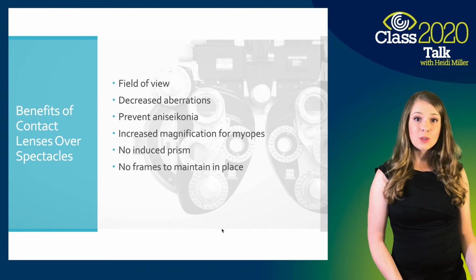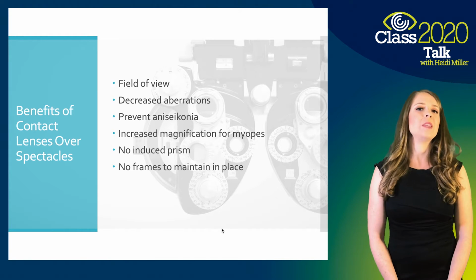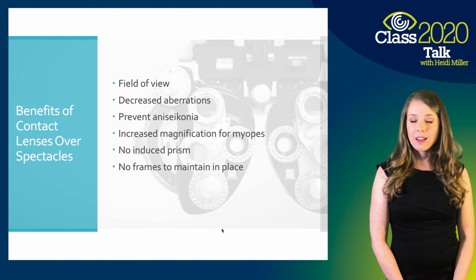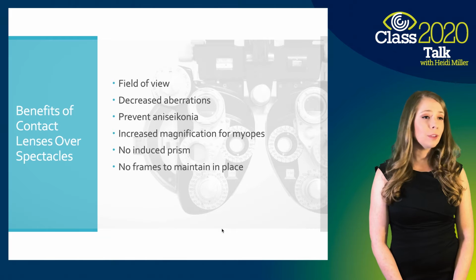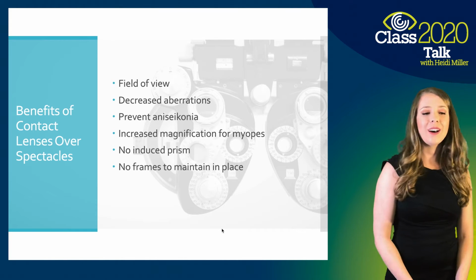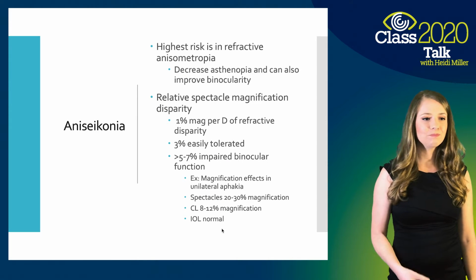You avoid induced prism when you're wearing contact lenses, and you don't have to worry about keeping a frame in place. So, glasses sliding down a child's face, not sure if they're getting full vision, if they're losing them at school, or if they're even wearing them at all. So with contact lenses, a little bit more reliability that they'll actually be wearing them all day.